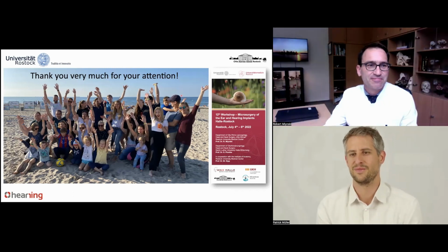Thank you very much, Professor Mlynski, for this detailed walkthrough of your surgery. I can see that we already have one question in the chat window from Timo Brecker. Timo, would you like to unmute yourself and ask your question, or should we just read it out? Okay, I'm not hearing anything, so I will just read it aloud, because it was very interesting.